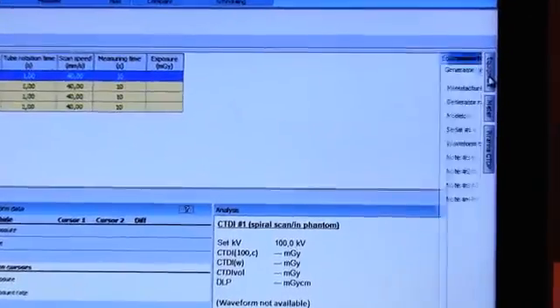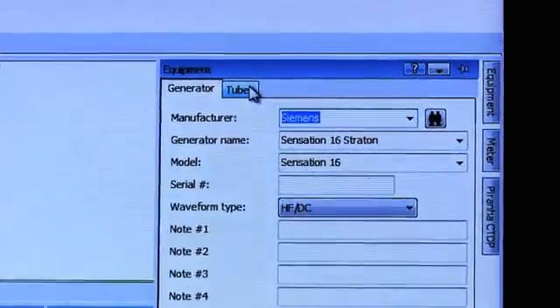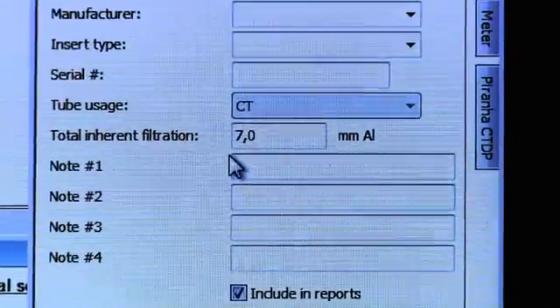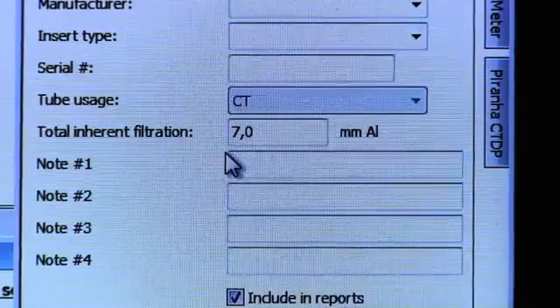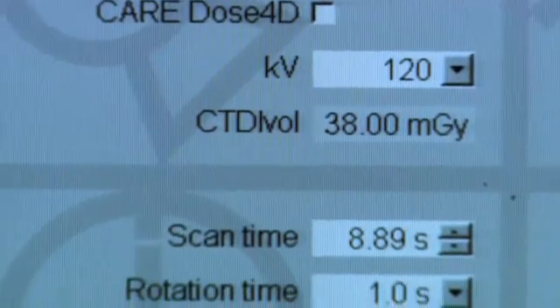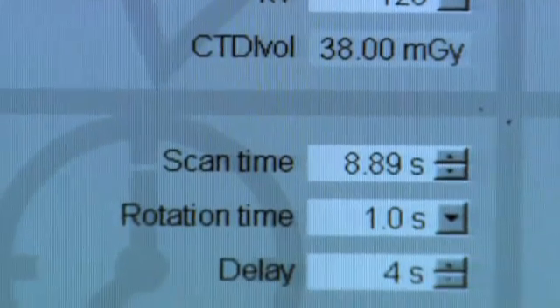If you know the total inherent filtration, you can add that too. Or you can use the default value of 7 mm of aluminum. Once the measurement settings have been set for the scan over the phantom, you should enter the measuring parameters into Ocean.